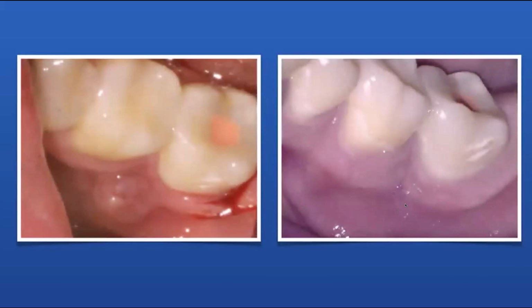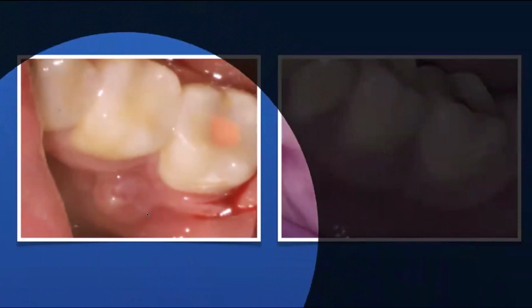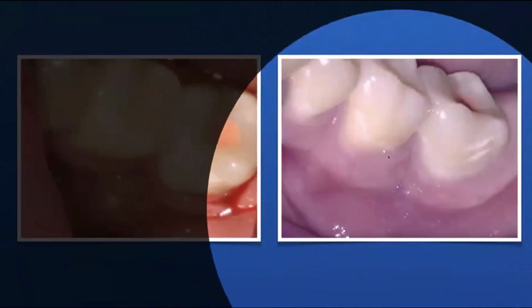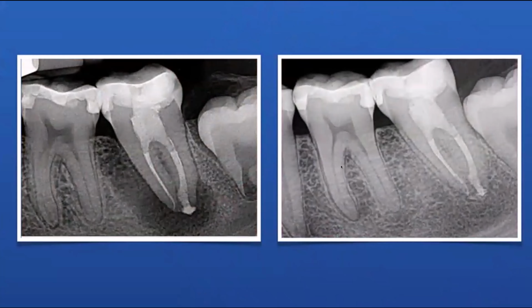This is the difference in soft tissue. One week later, I brought the patient back for a 1 week follow-up. You can see at the time of completion of treatment, when a patient has a swelling, this was actually a sinus tract that was enlarged. You can see 1 week later, it has resolved. And here's the recall at 6 months, full bone regeneration.